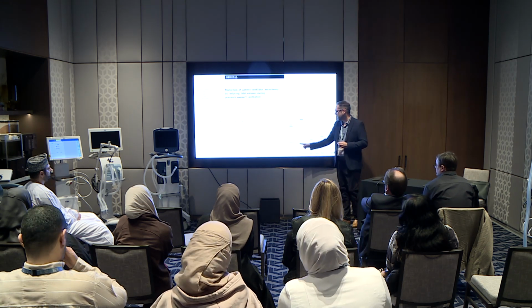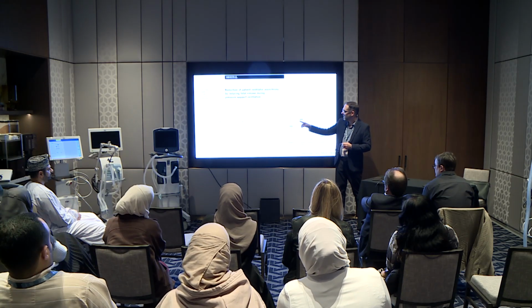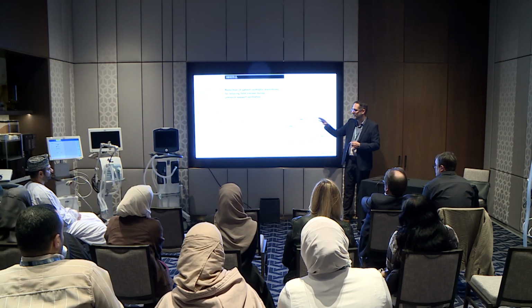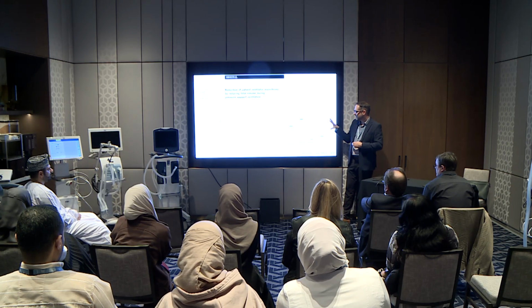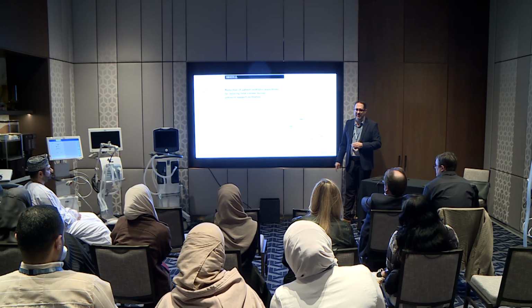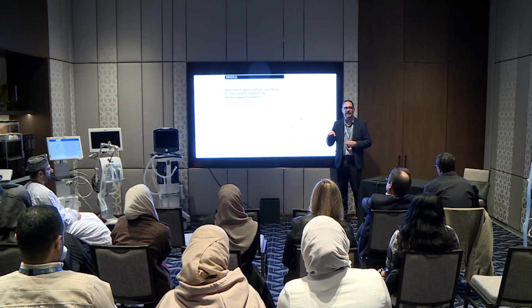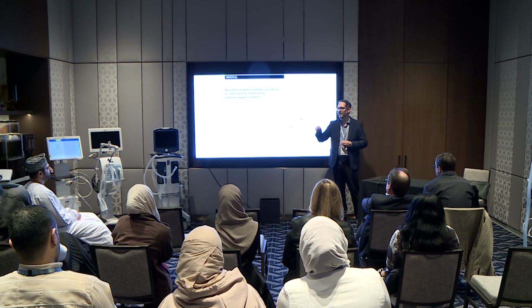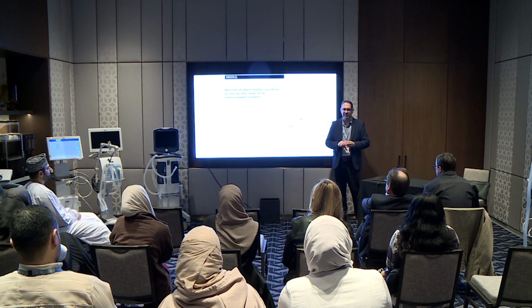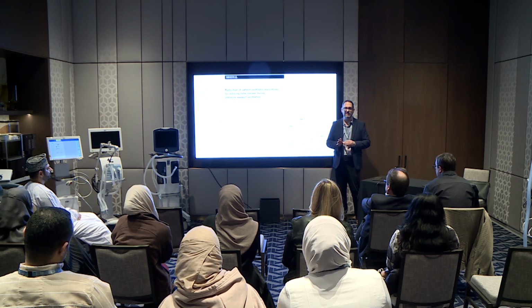So they did a study looking at what if we adjusted 0 PEEP and providing PEEP, can we impact ineffective efforts or asynchrony index, which was just the ineffective efforts. What they found the best solution was simply decreasing pressure support. And they said it was clear when they looked at the average tidal volume, it was around 10 mils per kilo before they reduced. And after they reduced it, can you guess what the average tidal volume was after reducing pressure support? It was about 6 point something, 7 mils.